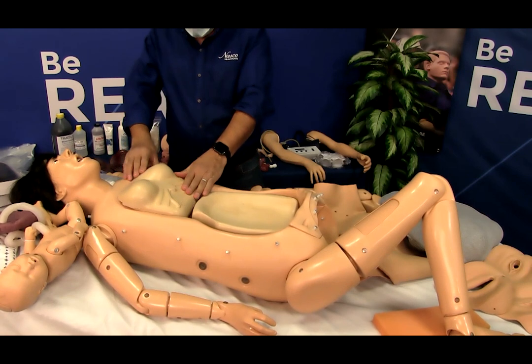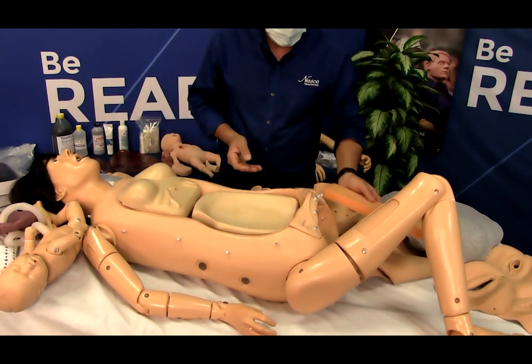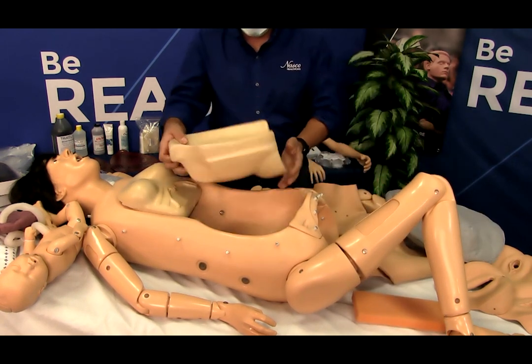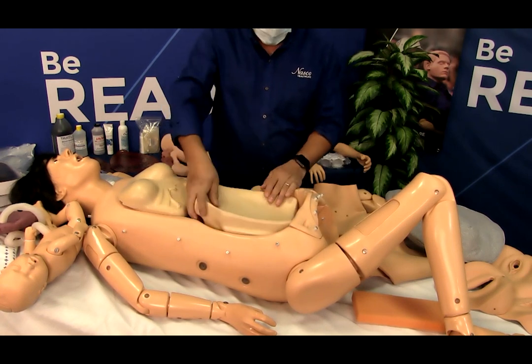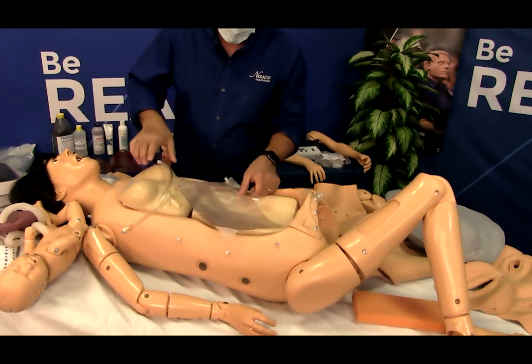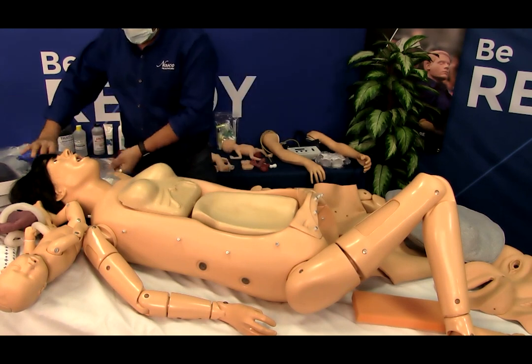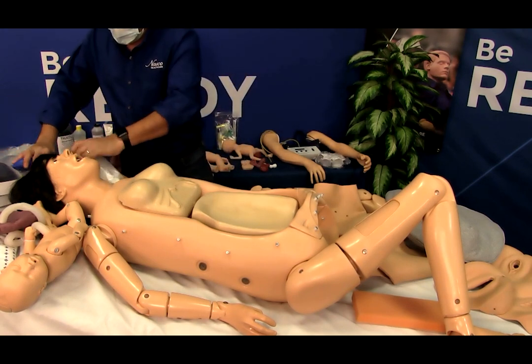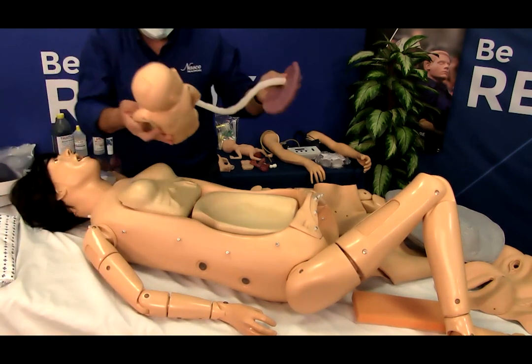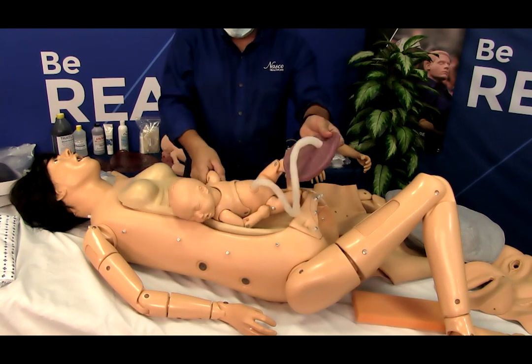Perineal skin foam stabilizer pad, the pelvic block, positioning bag, inflation tubing with squeeze ball, the placenta with a long umbilical cord, 3 short umbilical cords with clamp.